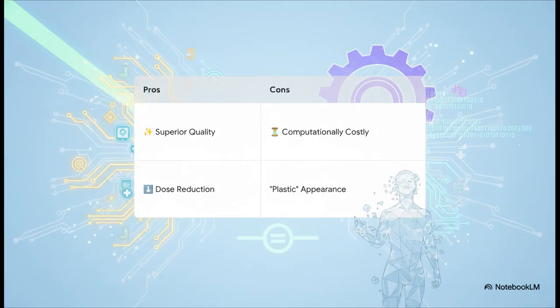So, this brings us to the big trade-off, right? On the one hand, these iterative methods give you absolutely superior image quality with way less noise. And that is a total game changer for lowering the radiation dose for patients. The catch? All of those loops, all of that comparing and correcting, it takes a ton of computing power. It's just way, way slower than FBP. And to be fair, some of the early versions got a bit of a reputation for making images look a little unnatural or plasticky. But the newer algorithms have gotten much better at that.